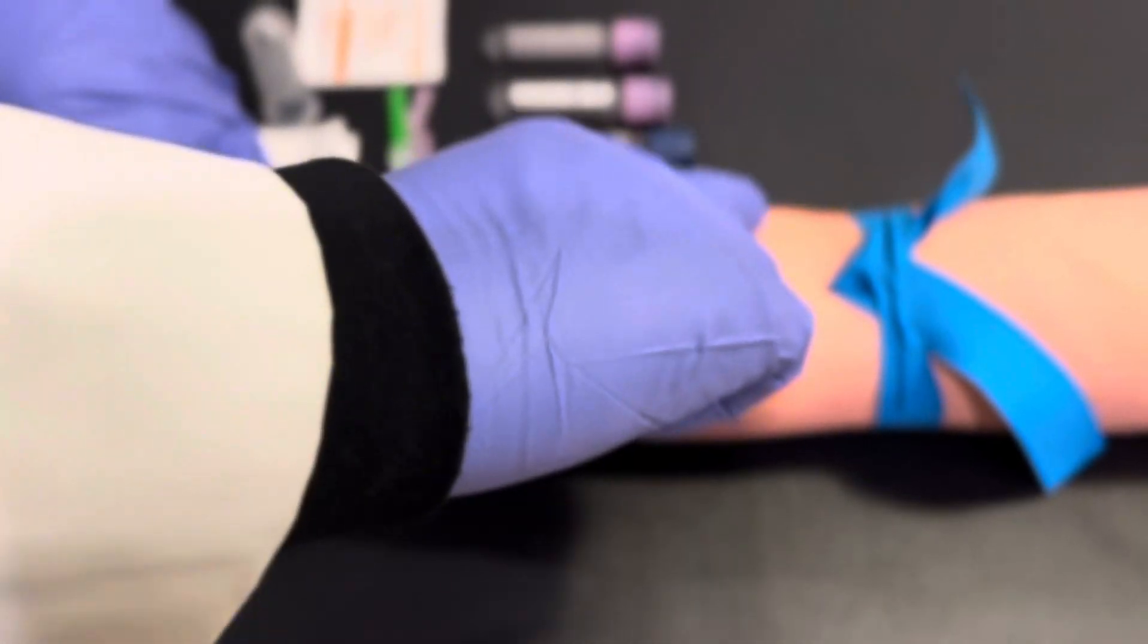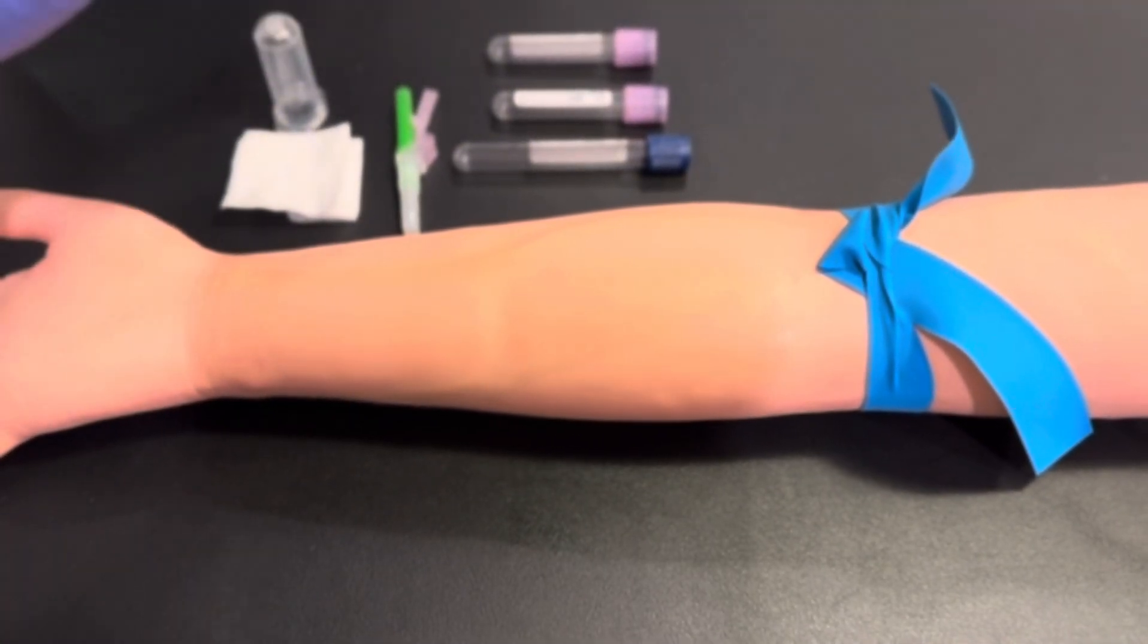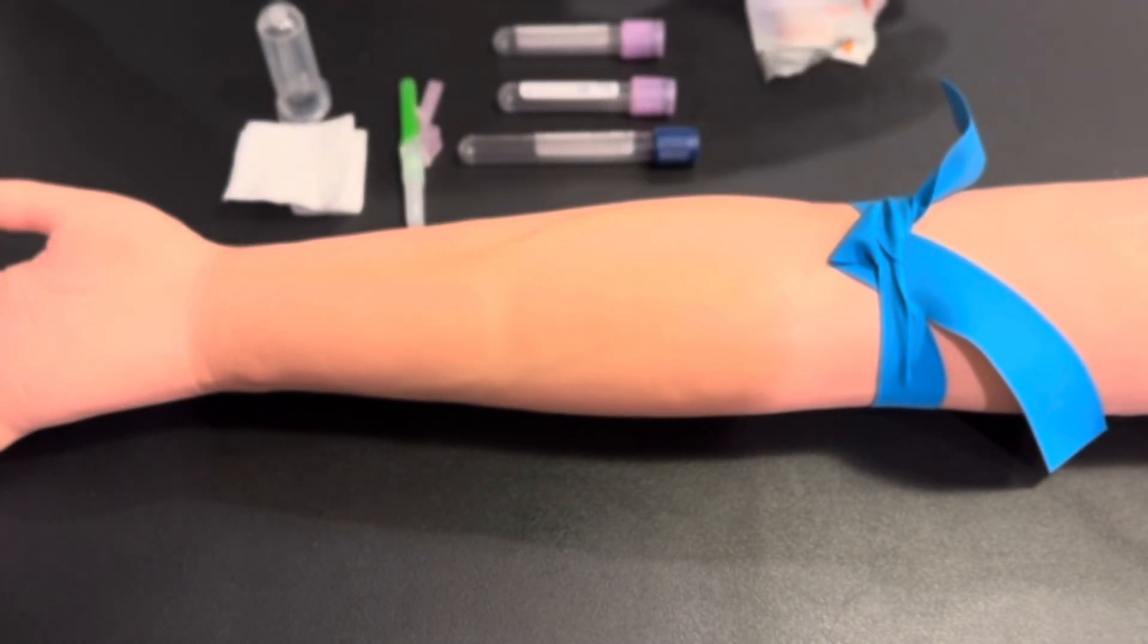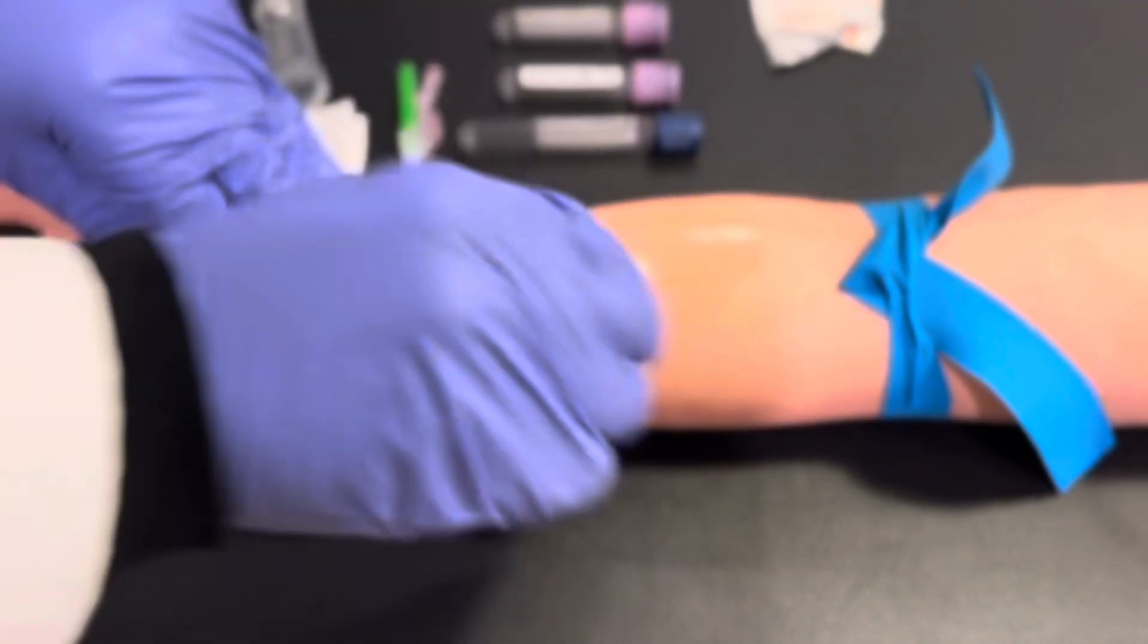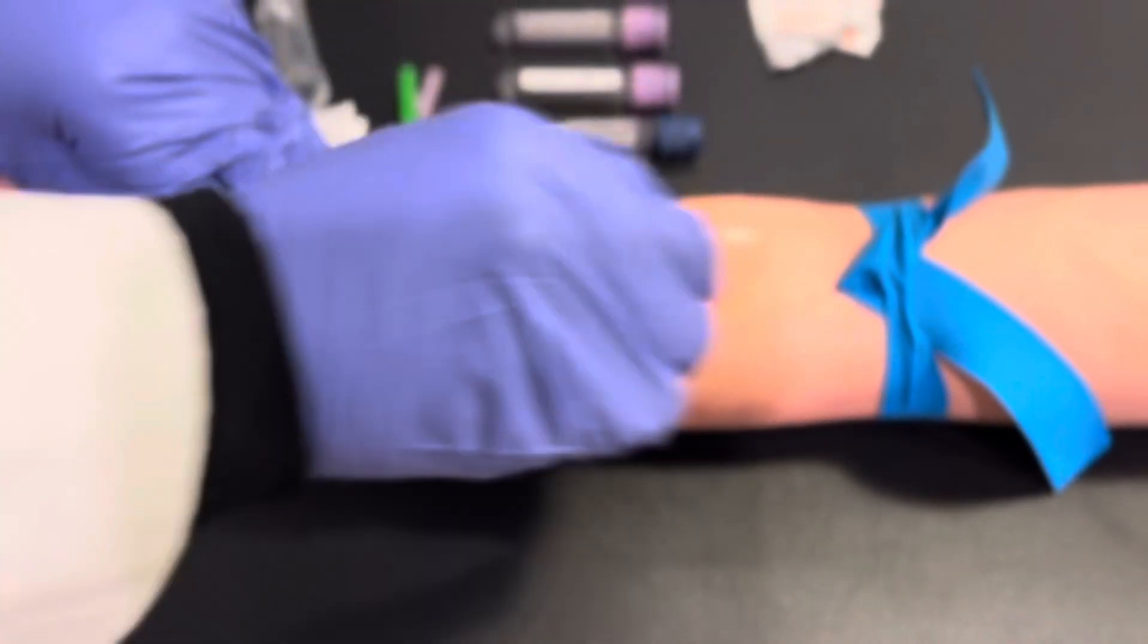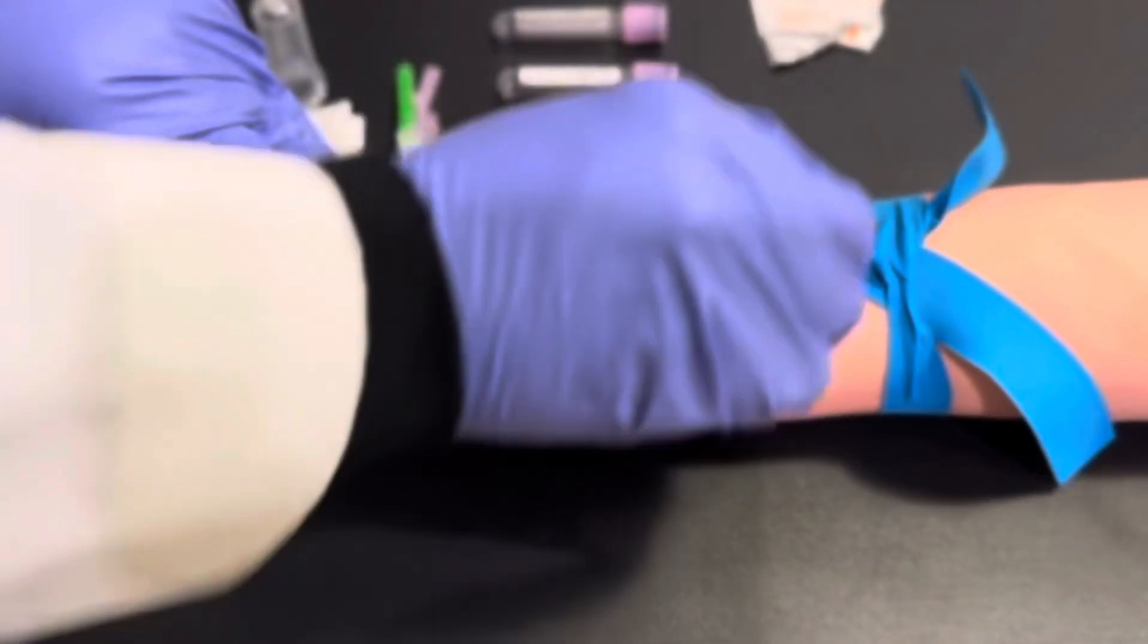Palpate for the vein, trying to locate either the median cubital vein, the cephalic vein, or the basilic vein. Clean the site in concentric circles with 70% alcohol and allow the site to dry.